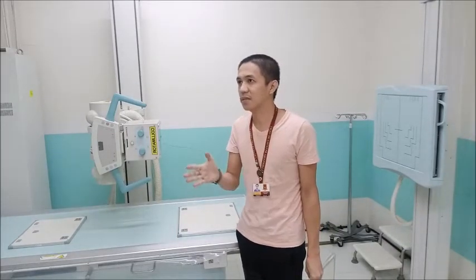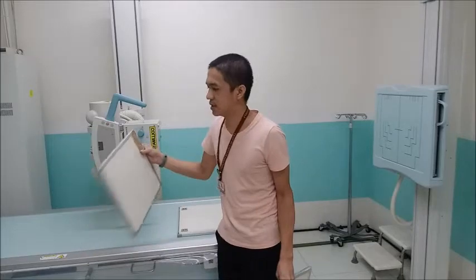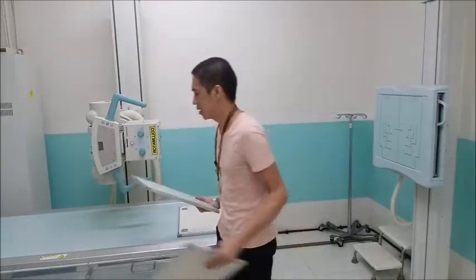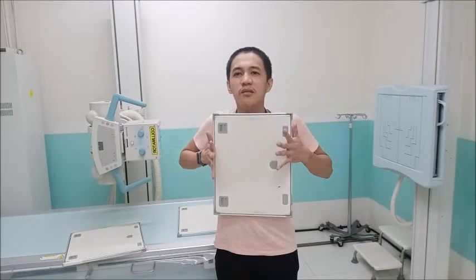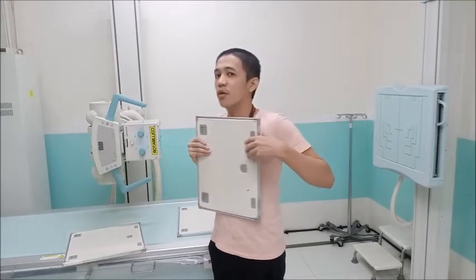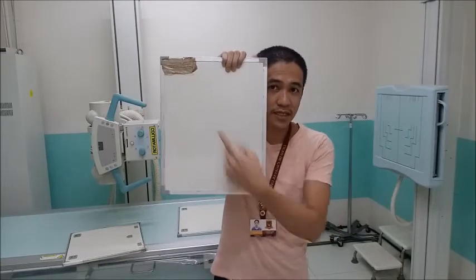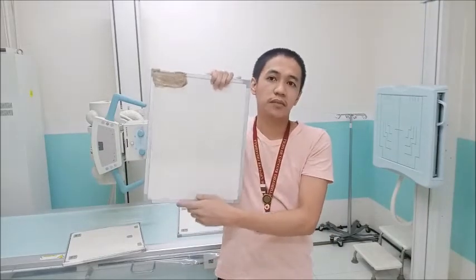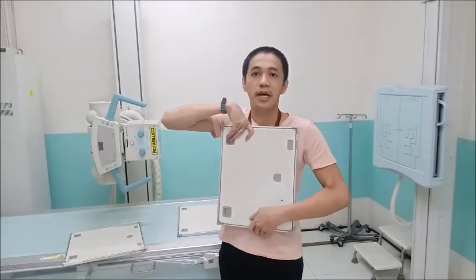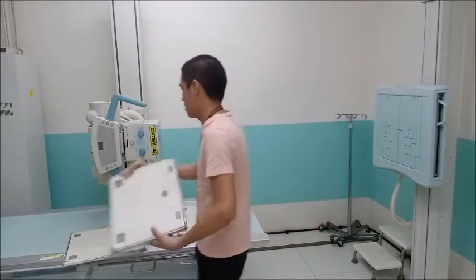Okay? So if it is a female, or maybe a male, but one who is slim and not very tall in height, maybe you can use the 11 by 14. Okay, so as long as it fits, you have to be very careful. For example, with the 11 by 14, it may seem to fit my thorax, just my chest, but actually the film is inside, not the cassette. The cassette is not our basis for the image, but rather the film inside. So that means even if it seems to fit, if we expose it now, some parts of the lungs will be cut off.